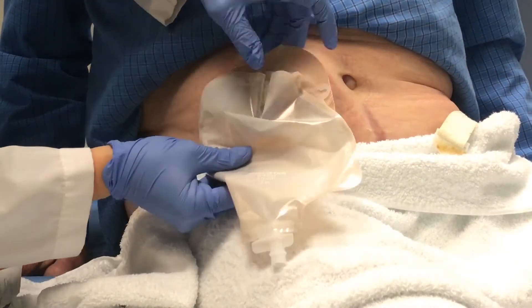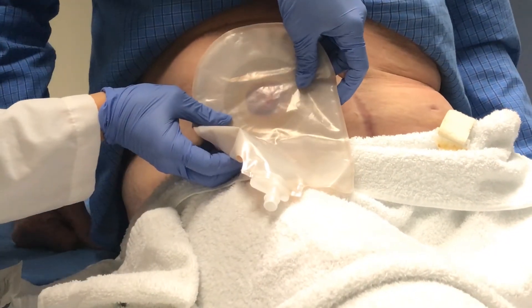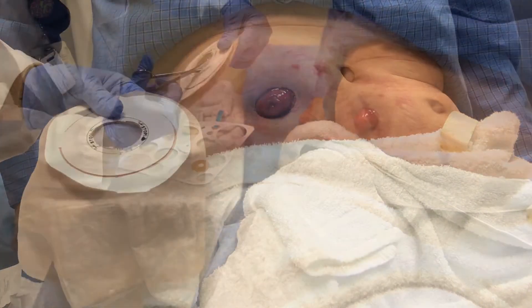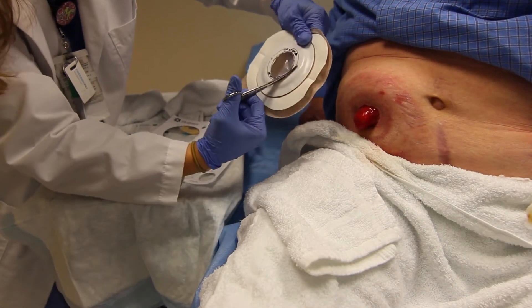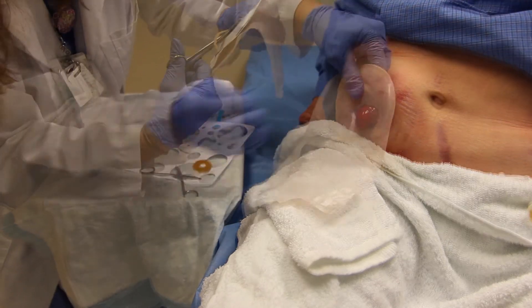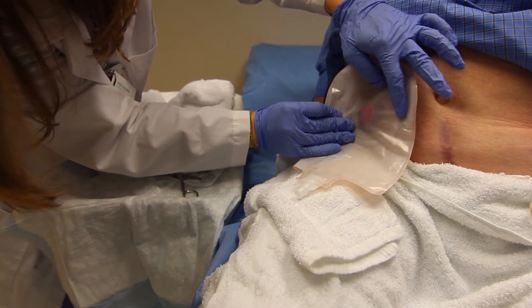Re-check to ensure you have the correct size, making sure that the pouch opening is on top of skin and not on the stoma. Make small adjustments as needed, ensuring not to cut too large. Re-check once more.